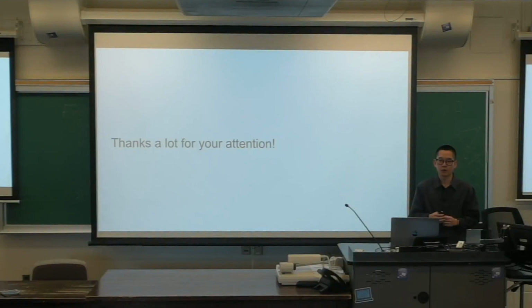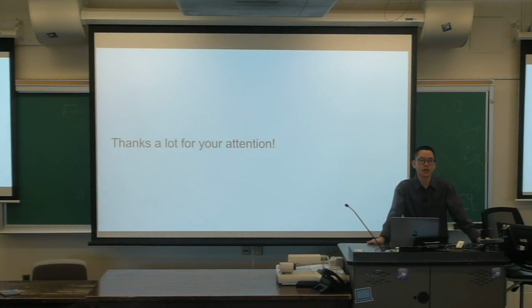Yeah, good question. How much slower would a neural network be for inference versus the LDA that you end up using? I think there will be a noticeable delay according to the subject, but it won't be so bad that it's not going to work at all. I think it's around 1 second, 0.5 second delay. But for LDA, the patient never noticed anything, so it's quite responsive.